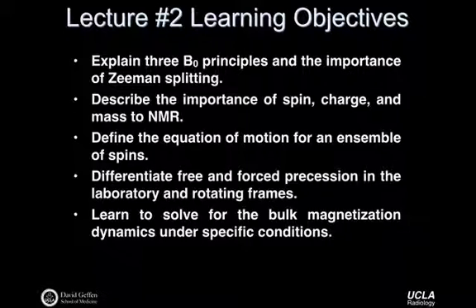We talked about free precession, and we talked about that in the laboratory frame. Today we're going to introduce the rotating frame, when we get into the spins and move with them at the Larmor frequency. We're also going to talk about not just free precession, but forced precession. That gets us to our next learning point, which was differentiating between free and forced precession. What was free precession? Does anyone want to give one sentence? Say it again.